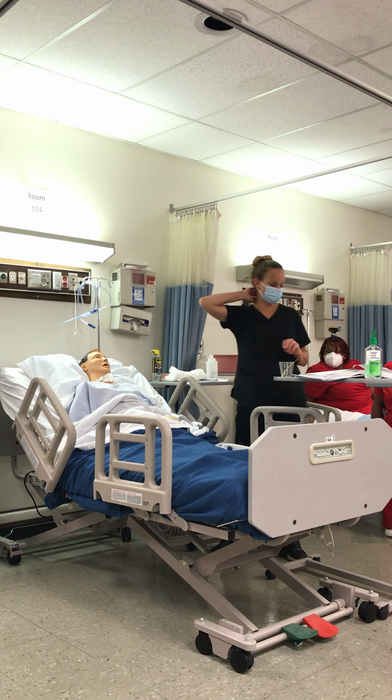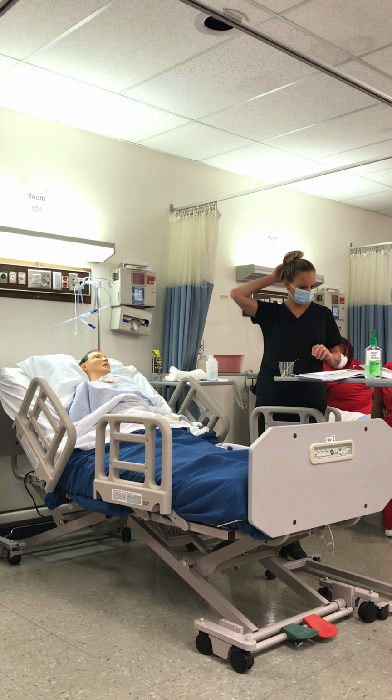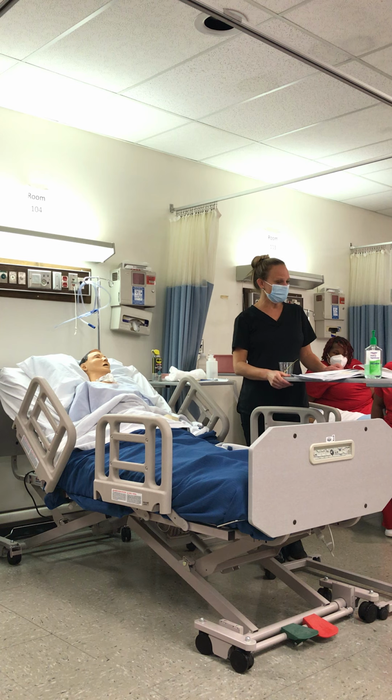Especially for those patients that are what? Or have problems swallowing. We would want to get their dentures out, anything that's loose in there, because we don't want to knock it with that tube or anything we're doing, knock those loose and then have issues with possibly swallowing.